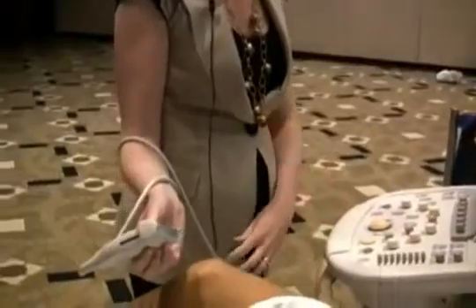We're going to do a basic knee demonstration using the Philips IU22 system. I have a linear 12 transducer, which is the best for knee examinations.